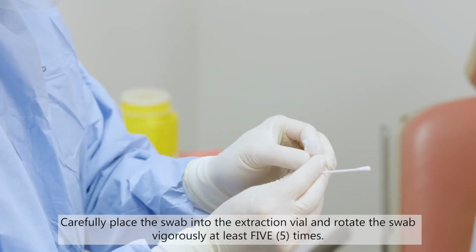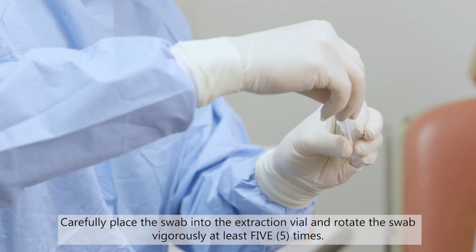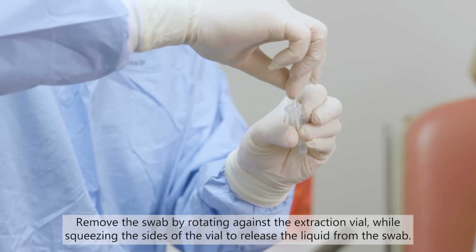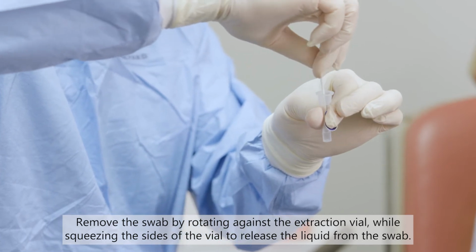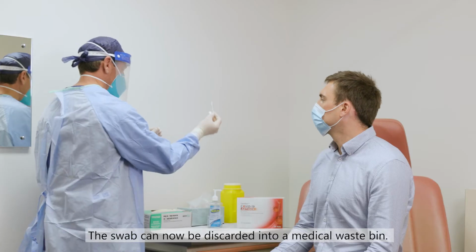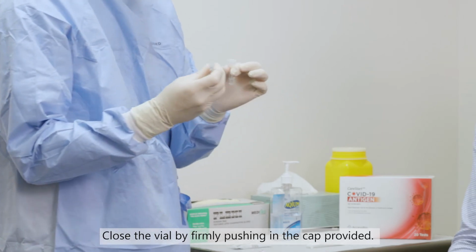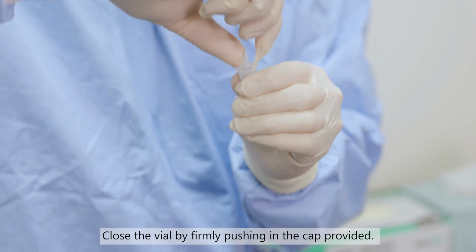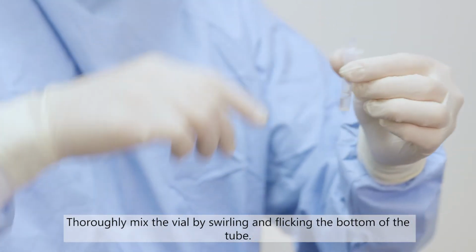Carefully place the swab into the extraction vial and rotate the swab vigorously at least 5 times. Remove the swab by rotating against the extraction vial, while squeezing the sides of the vial to release the liquid from the swab. The swab can now be discarded into a medical waste bin. Close the vial by firmly pushing in the cap provided. Thoroughly mix the vial by swirling and flicking the bottom of the tube.